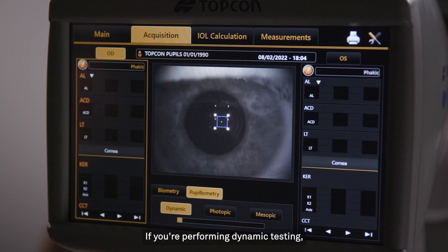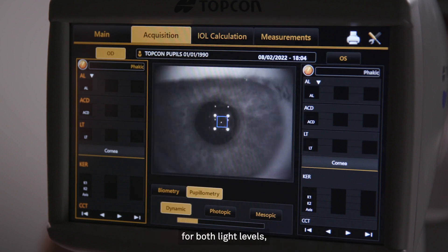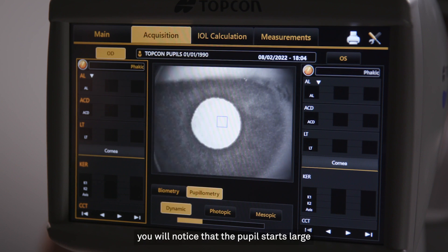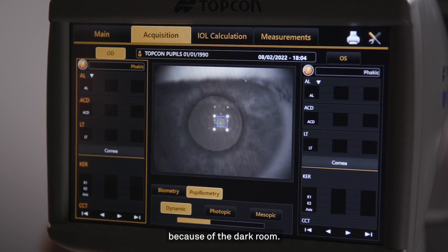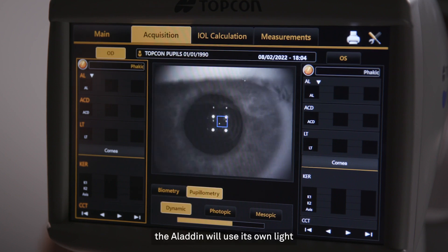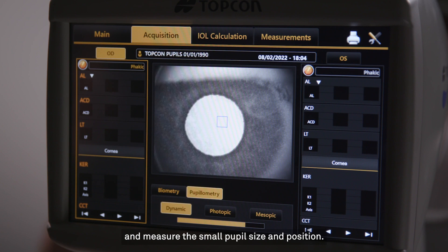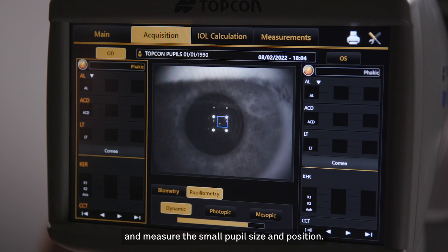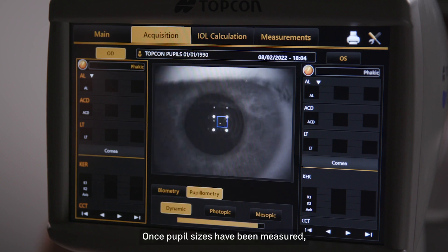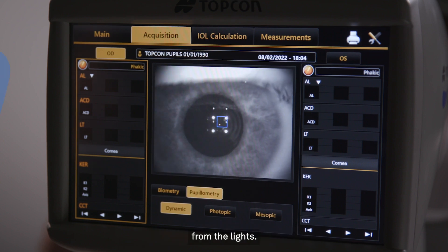If you are performing Dynamic testing, which is the quickest assessment for both light levels, you will notice that the pupil starts large because of the dark room. After measuring the size and position of the pupil, the Aladdin will use its own light to shrink the pupil and measure the small pupil size and position. Once pupil sizes have been measured, the Aladdin will create a short video clip documenting the pupil recovering from the lights.